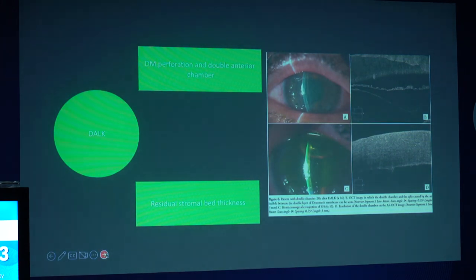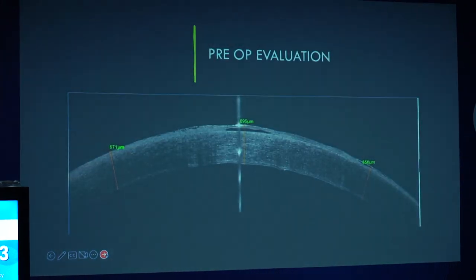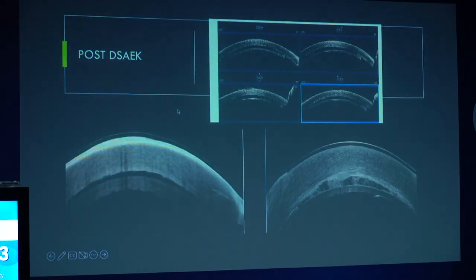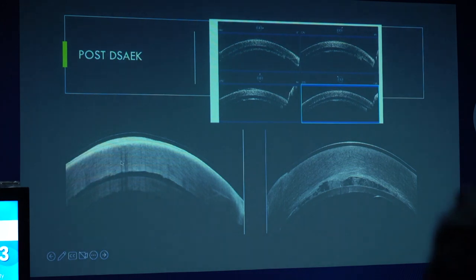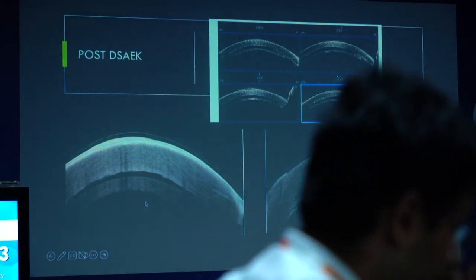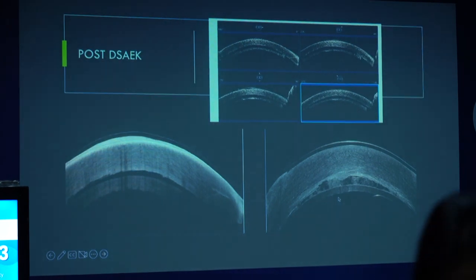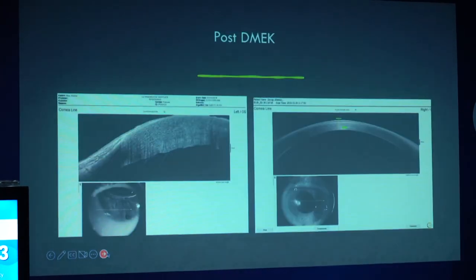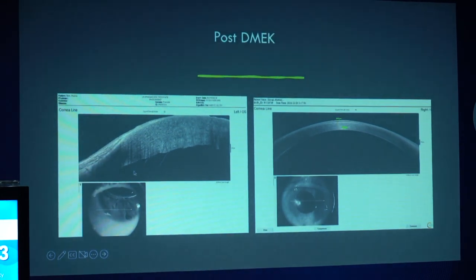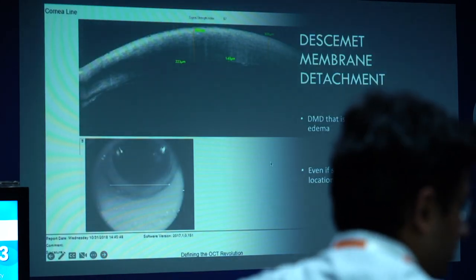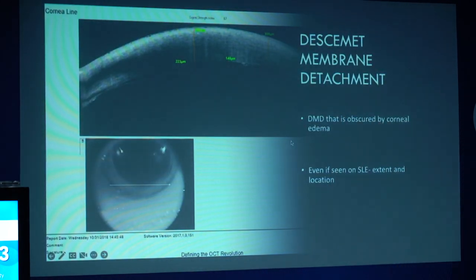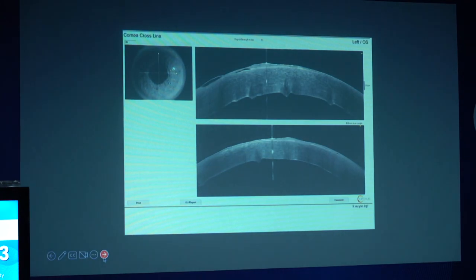Lastly, touching upon keratoplasty: in patients with DALK, to identify complications like double anterior chamber; preoperative evaluation in patients undergoing endothelial keratoplasty; and patients post-DSEK where three different complications can be seen — significant detachment of the lenticule, an inverted DSEK lenticule, and significant interface haze. In patients post-DMEK, OCT assesses attachment of the lenticule and presence of detachment in the periphery. Post cataract surgery, Descemet's membrane detachment can be monitored, with OCT helping in estimating the extent and location of the detachment.